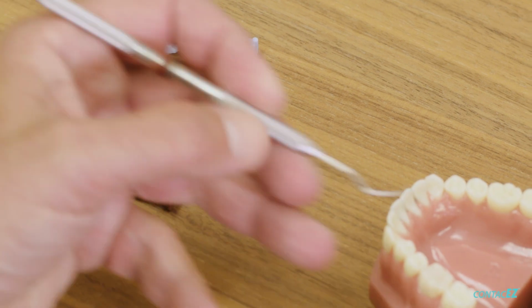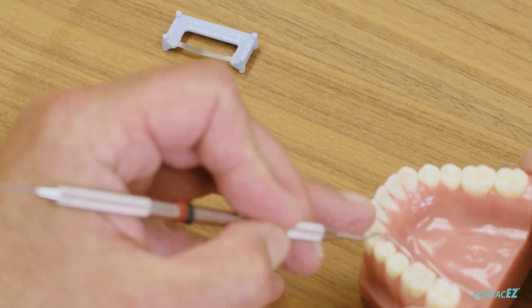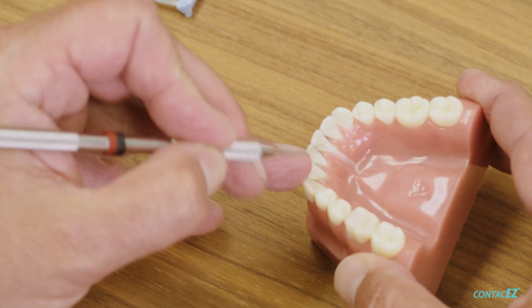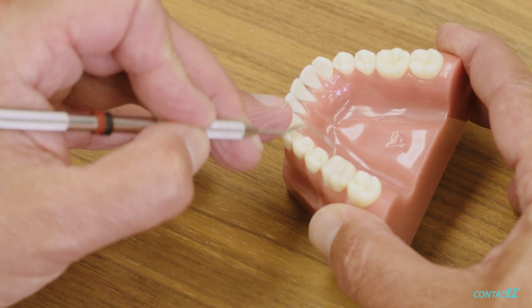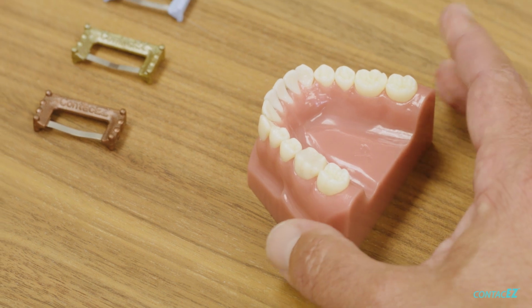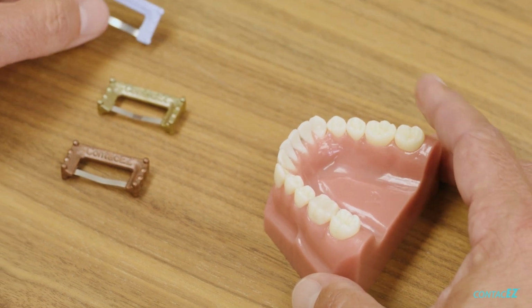But we've got a composite in this tooth, and it's got a nice overhang on it. I just put it in real quickly, intentionally with an overhang. That's how most of my composites are anyway, so it wasn't too difficult for me to do that.